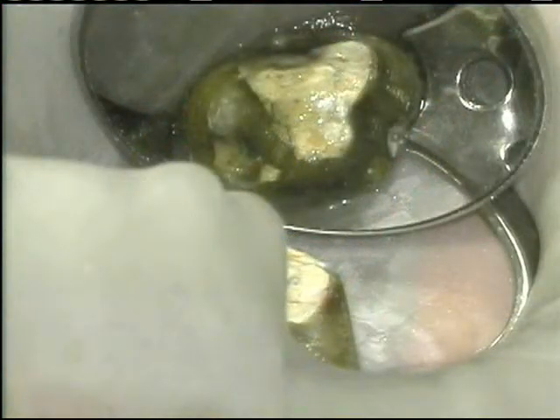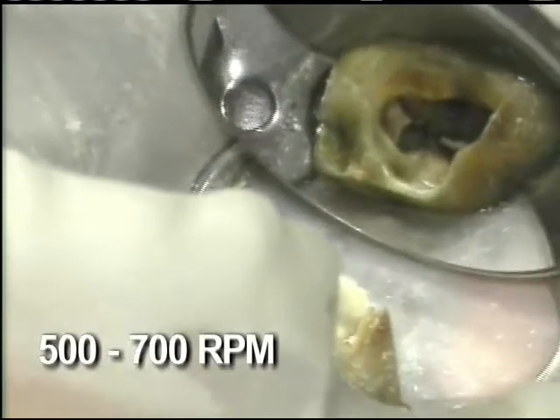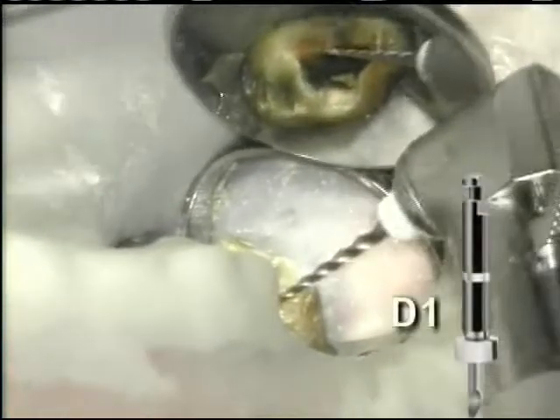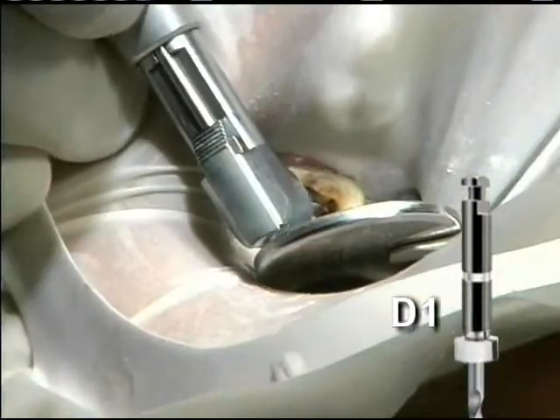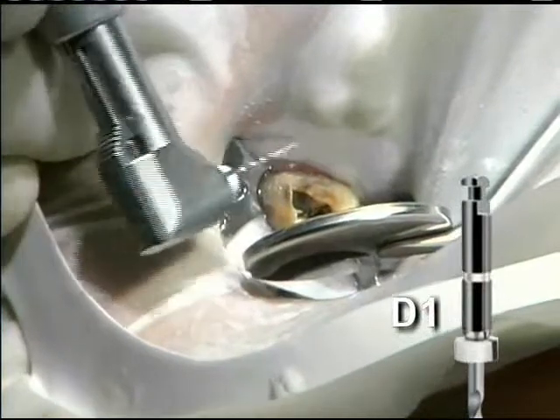In this example, a carrier and gutta percha is to be removed. The ProTaper Retreatment instruments are utilized at 500 to 700 RPM. Without engaging the dentin, the spinning D1 is gently pressed into the gutta percha. Heat and friction will help to remove obturation materials.